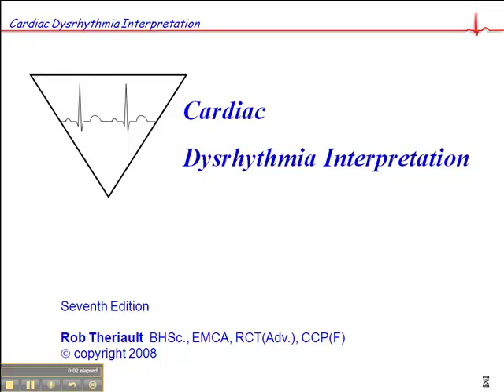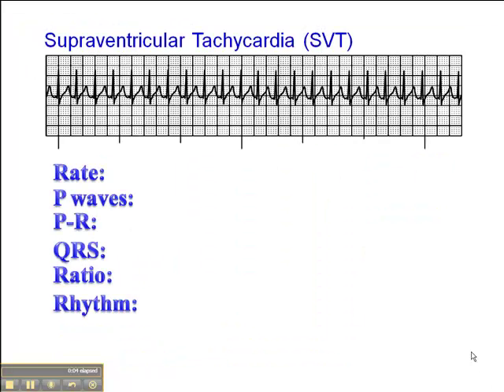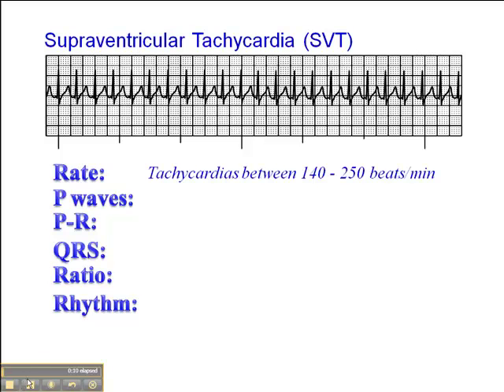We're on page 52 of the cardiac dysrhythmia interpretation workbook, and I want to talk about supraventricular tachycardia. In an SVT, tachycardias are typically between 140 and 250 beats per minute. Keep in mind, as described in the earlier slide presentation on sinus tachycardia, that if a patient is at rest and has a heart rate greater than 160, it's very unlikely to be sinus tachycardia, even if you see discernible P-waves preceding each QRS.